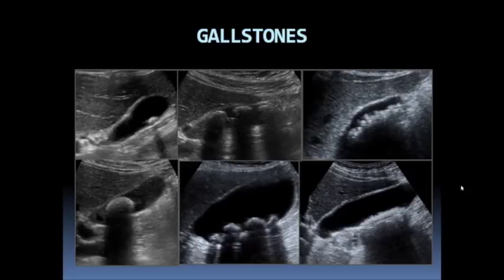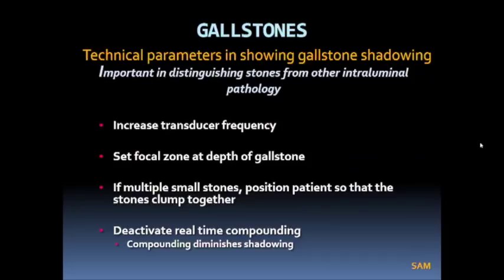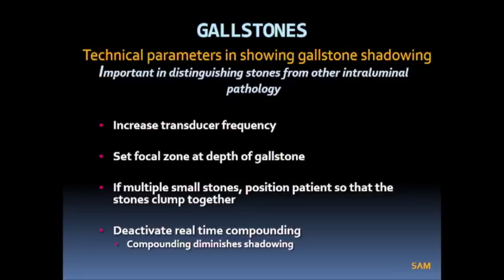Here is a spectrum of the ways gallstones can appear — different sizes and appearances, all echogenic luminal structures that shadow. To distinguish stones from other intraluminal pathology, we must understand technical parameters that affect shadowing. One such parameter is transducer frequency: sound is absorbed at higher frequencies, so increasing transducer frequency can allow a small non-shadowing stone to demonstrate shadowing.